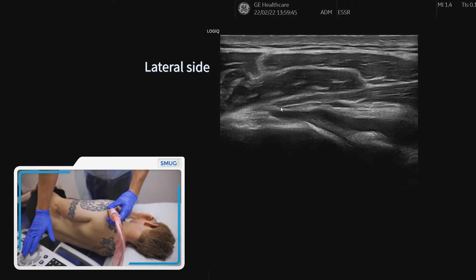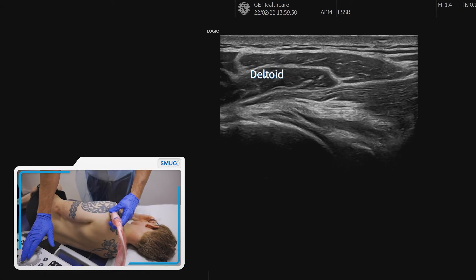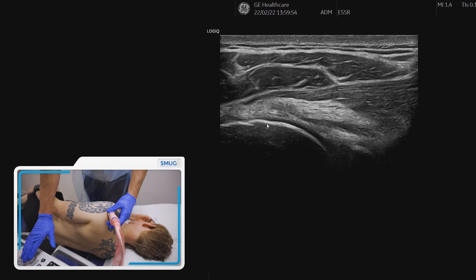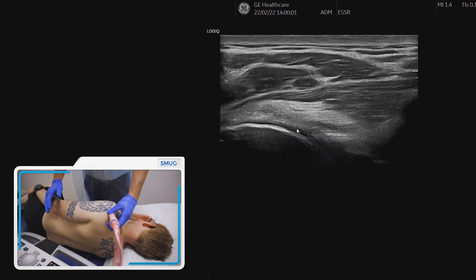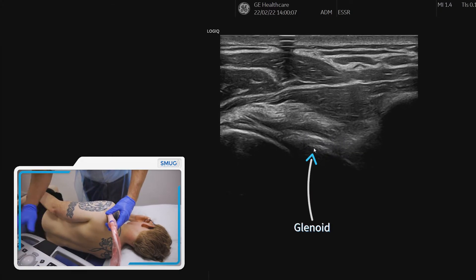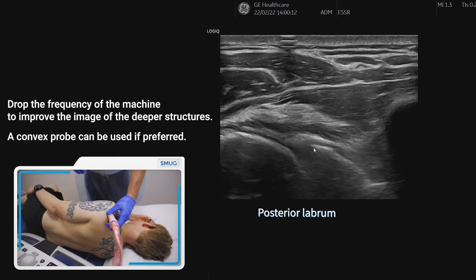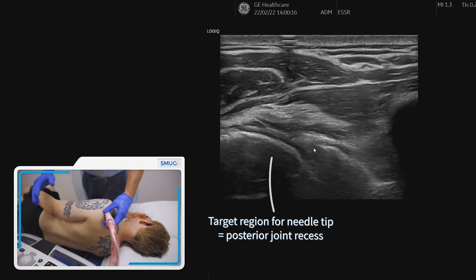Looking at the image, what we can see here is the skin, subcutaneous tissue, deltoid, and quite clearly — which is a nice landmark — you can see the humeral head, which is obviously nice and round and bright, and you can see the articular cartilage on top of there. If we slide further around to the back, you can quite nicely now see the glenoid. I would recommend at this point, even on top-end machines, that you reduce your frequency. I'm down to 10 megahertz and you can see that's given me a really nice image.